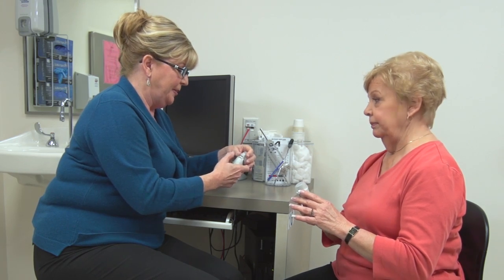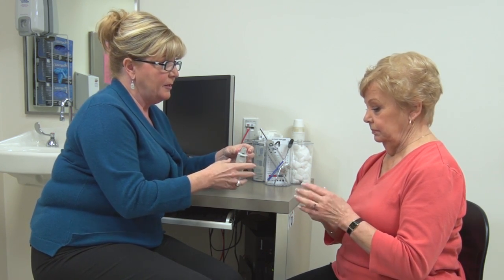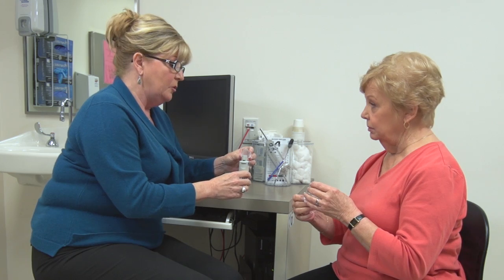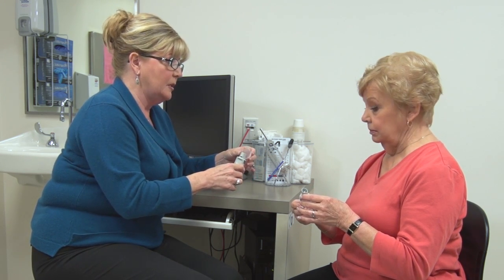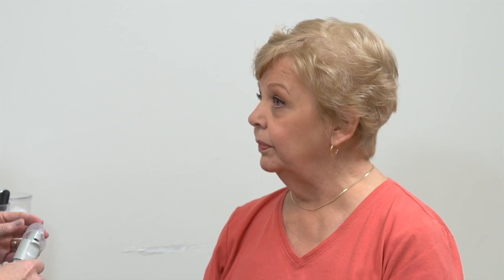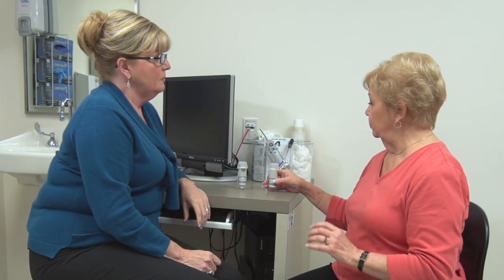The device should be cleaned at least once a week or as often as the patient likes. To clean it, take a damp cloth and wipe around the mouthpiece, including the little silver piece inside. Do not put it into a sink of water or under the faucet to clean. Then simply cover the mouthpiece and the device is ready to be stored for the next dose.